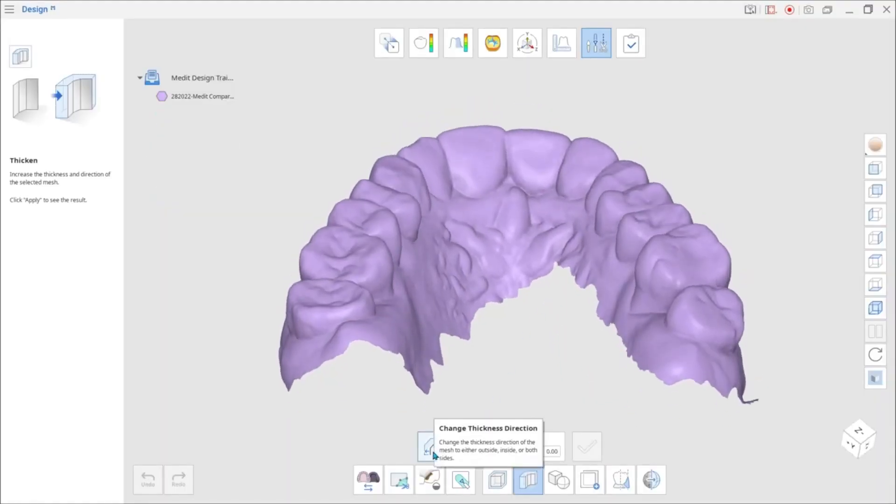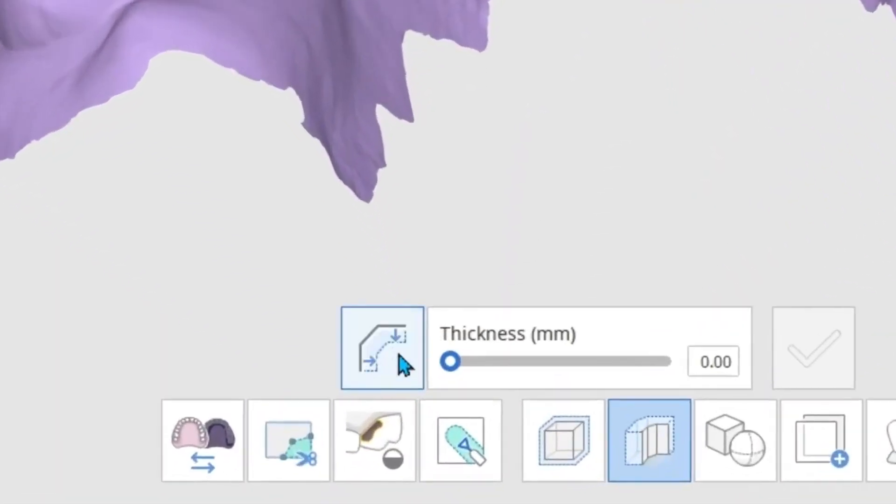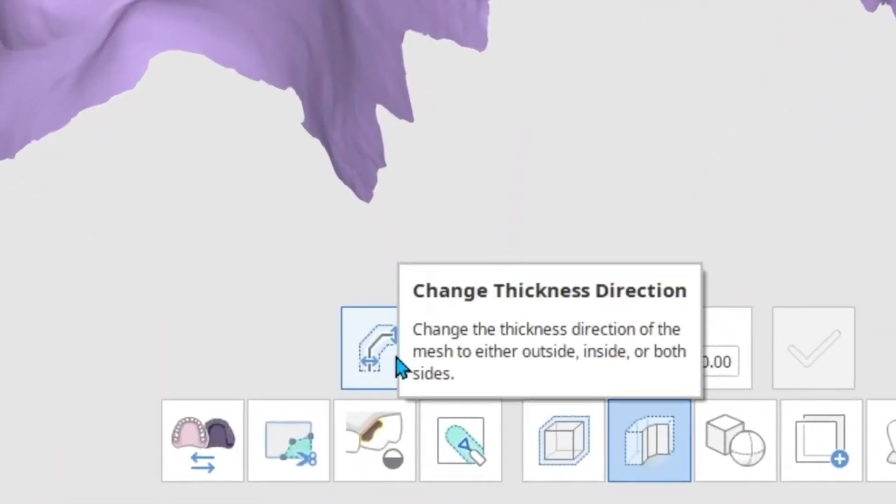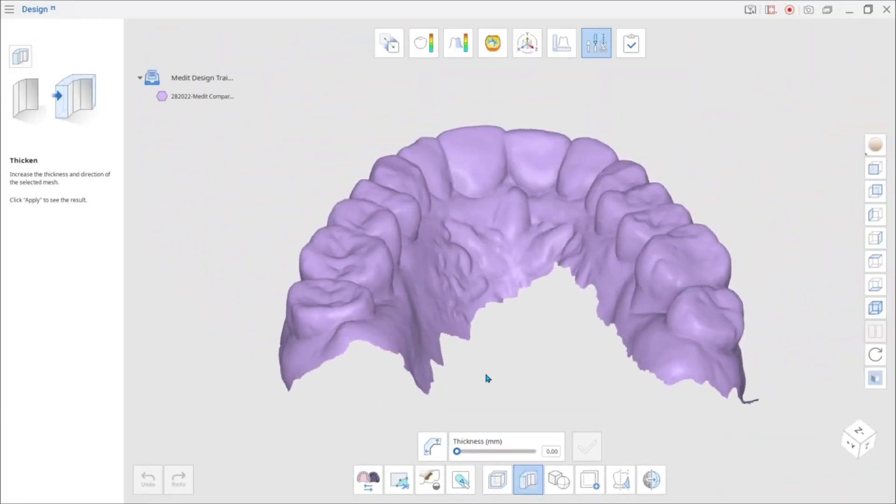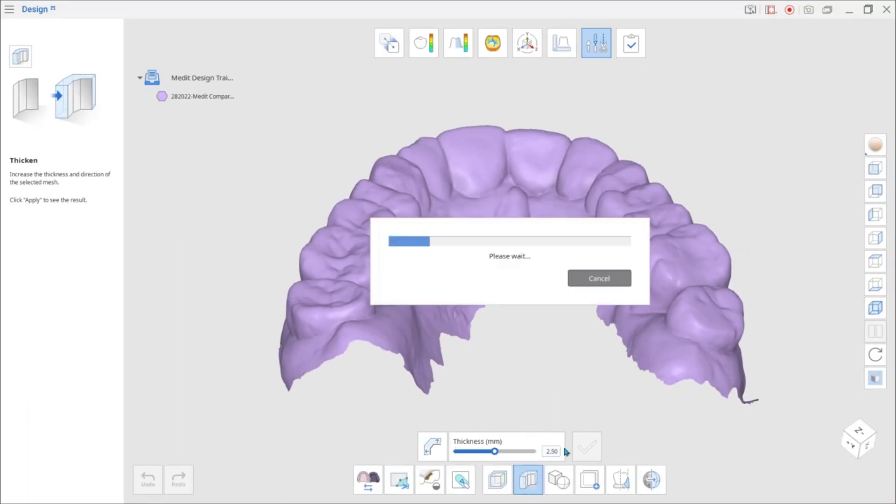Click the icon next to the slider to change the thickness direction of the mesh to either outside, inside, or both sides. Remember to click Apply to save your changes.